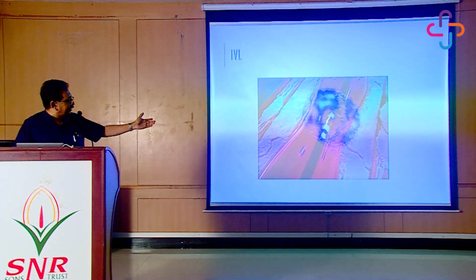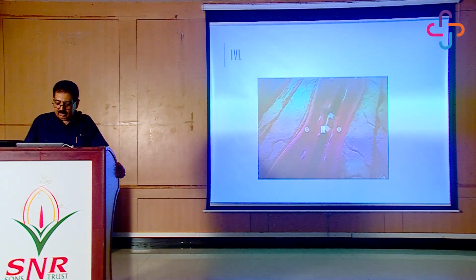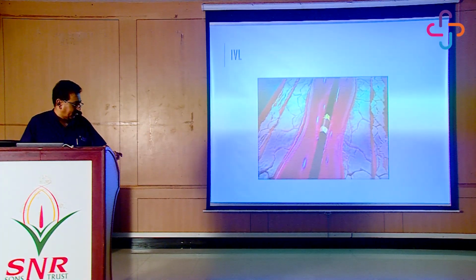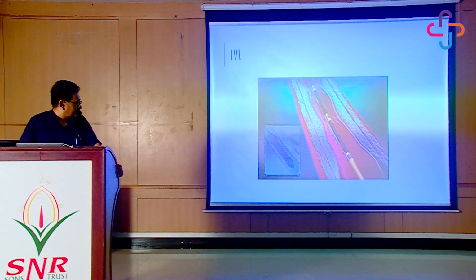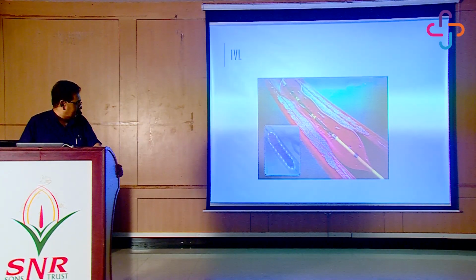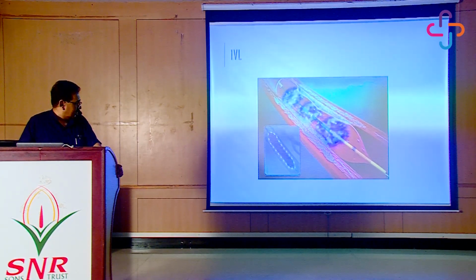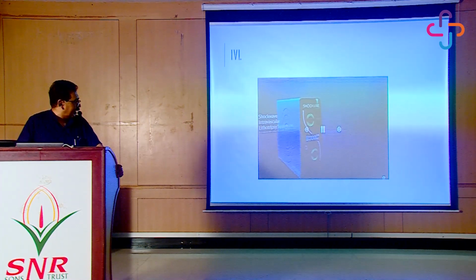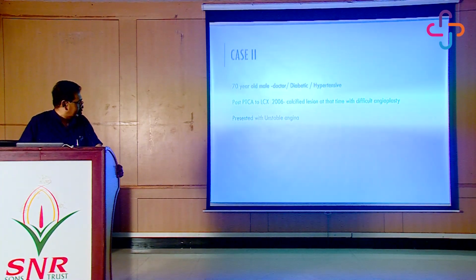You can see the cracks in the calcium which happen. So subsequently we can expand with the balloon and deploy the stent.